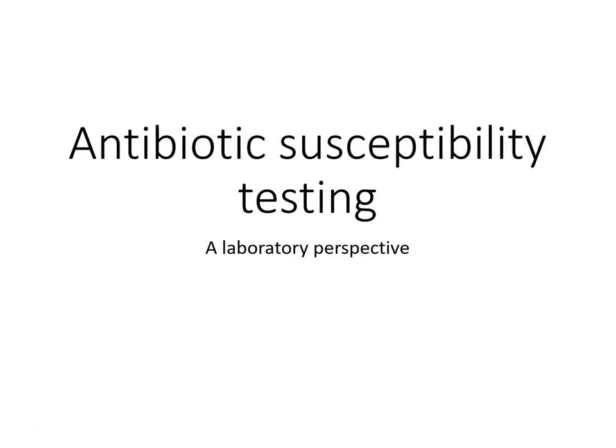This is the virtual lab for antibiotic susceptibility testing. This is a big thing that happens in clinical labs. What we're trying to figure out when we do this is what antibiotics the clinic can use to treat a bacterial infection. So if a patient has a bacterial infection and you manage to isolate the bacteria that are causing that infection, what antibiotic can you use to treat them?